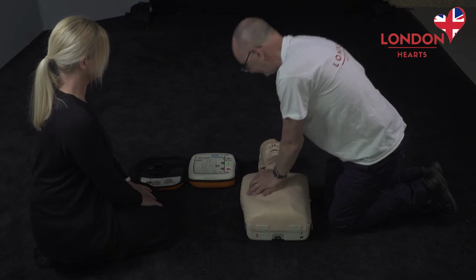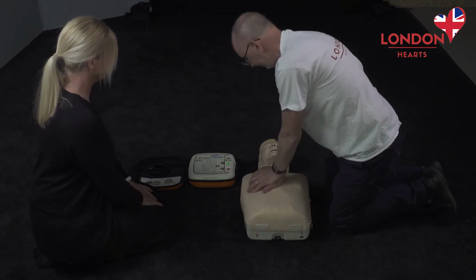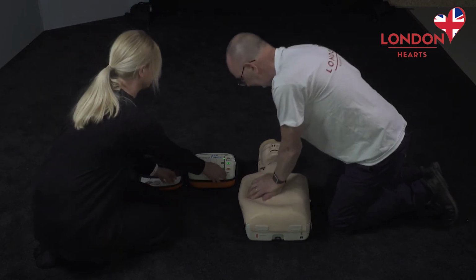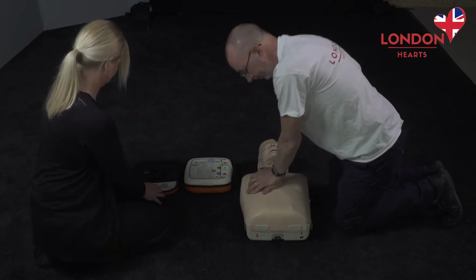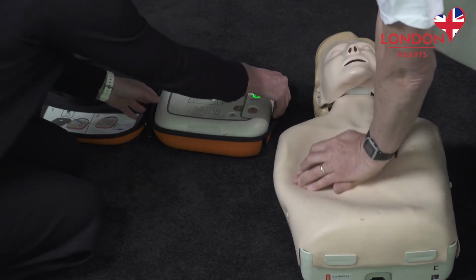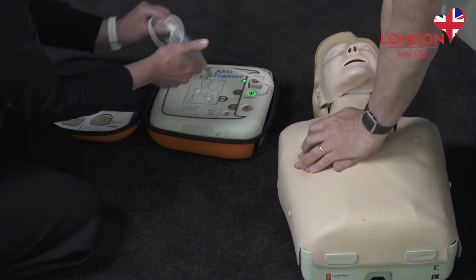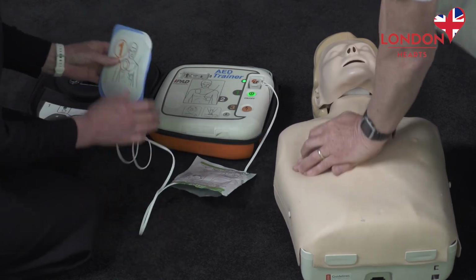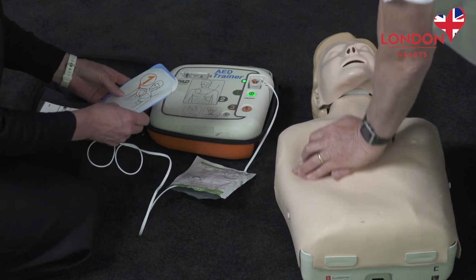Call emergency medical services now. Adult mode. Follow the voice prompt calmly. Remove all clothing from chest and stomach. Rip clothing if necessary. Take out the pads from the bottom of the device. Tear open the pad's packaging. Look closely at the picture on each pad.